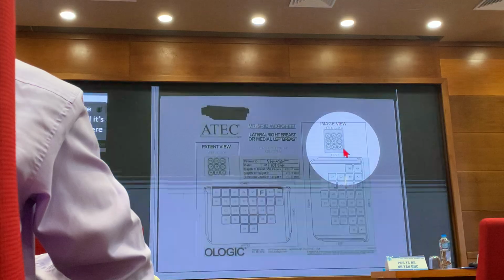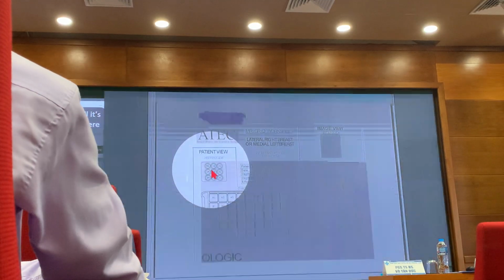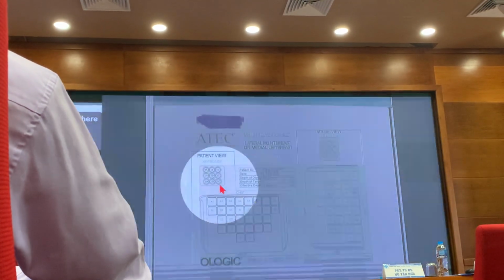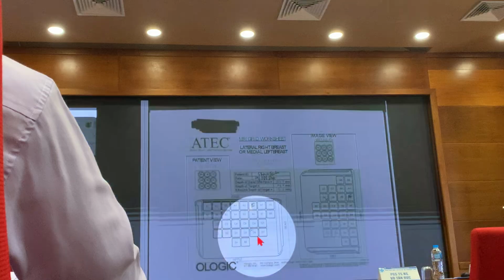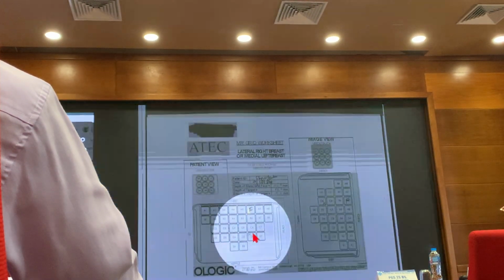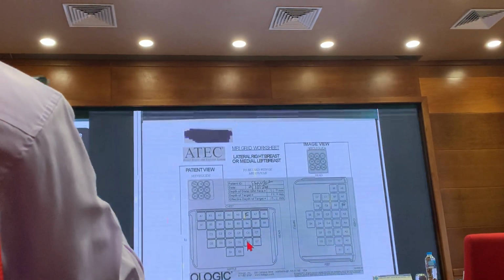After we notice this is 1A and D6, we will go to here. 1A is over here and D6 will represent this box at the left upper first one. D6 here. This is the location that we're going to set to go in and get the tissue sample.